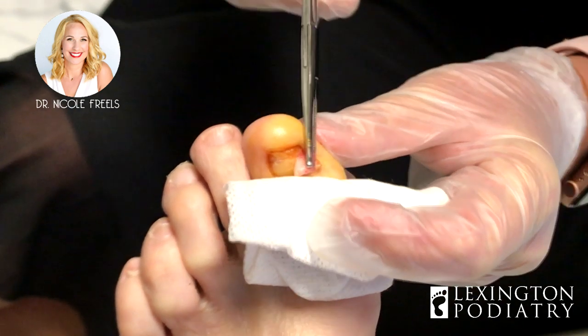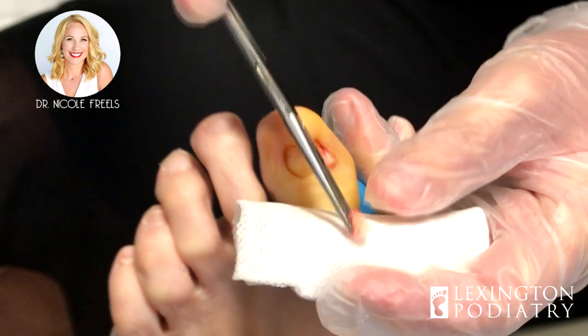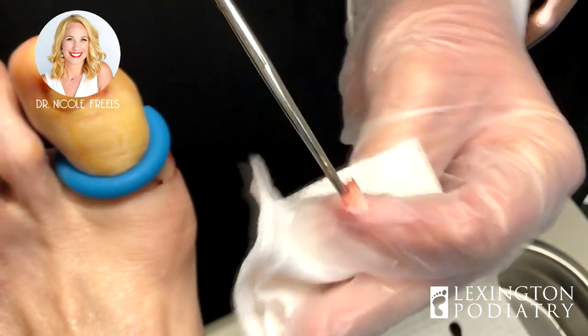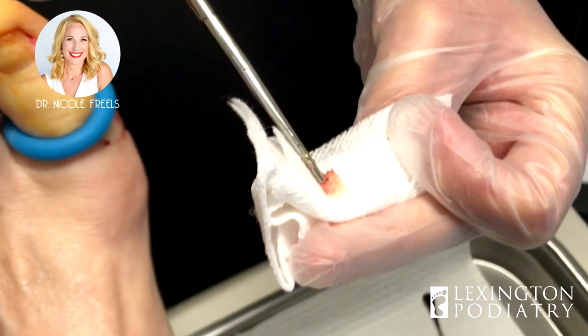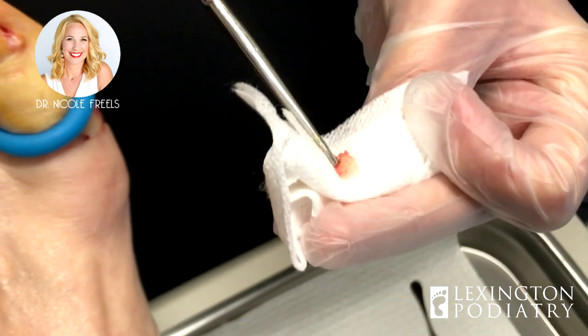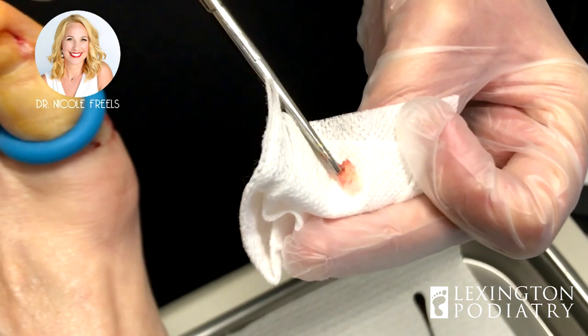All right, here we go. So this is what you have been digging for. Isn't that crazy? All of that. It's large. It is — and a lot of times we can't really feel it, but once we get in there, we're like, I can't believe that was in there.